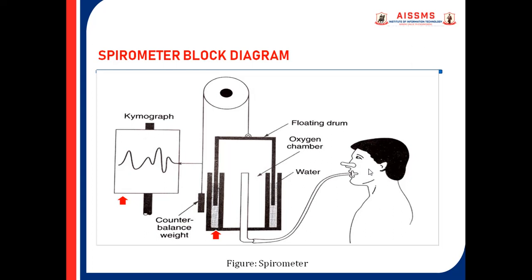The excursion of the bell will be proportional to the tidal volume. For most purposes, the bell has a capacity of the order of 6 to 8 liters. Unless a special lightweight bell is provided, the normal spirometer is only capable of responding fully to slow respiratory rates and not to rapid breathing, sometimes encountered after anesthesia.